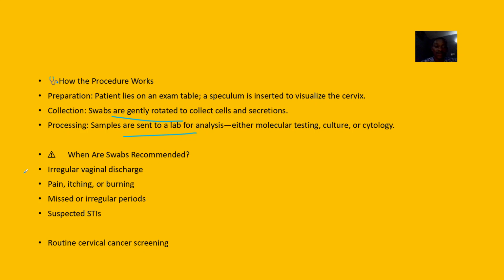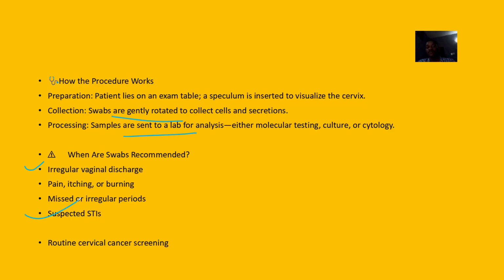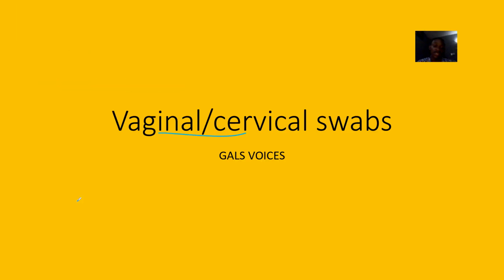So why are they recommended? If the patient is having irregular vaginal discharge, pain, itching, a burning sensation, missed or irregular periods, or if you suspect that there's some sexually transmitted infection, you might want to go in for any of these, just to help you detect, depending on the area which is of interest to you.